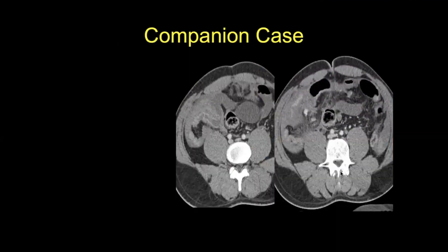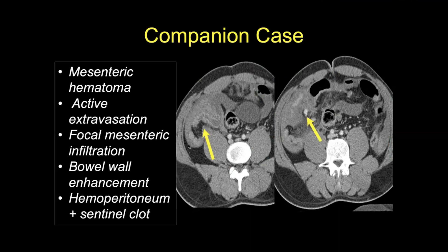A companion case with a more obvious injury: note the active bleeding within the mesenteric hematoma, hyperemia of the bowel loops, and hemoperitoneum consistent with active bleeding within the mesentery, as well as associated bowel injury. Patients with active extravasation within the mesentery are more often treated surgically because of the frequent underlying association of bowel injury.